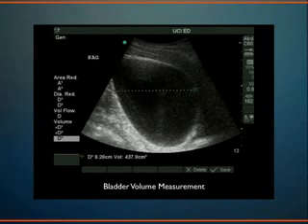Yes? When would you want to measure the bladder volume? Like why do you care about measuring the bladder volume? It's something that we want to know about actually quite frequently in the hospital, at all ages. In little babies who have a fever, we want to basically cannulate their bladder, put a catheter in their bladder to get the urine out, to send it off for urine culture. Well, some of them just urinated in their diaper, and you would unnecessarily put them through the procedure of a bladder catheterization, which is painful. So you could avoid that; you have to wait until the bladder fills up, basically. So I train my nurses to do this, and they take a peek at the bladder before they bother putting a catheter into a small child.